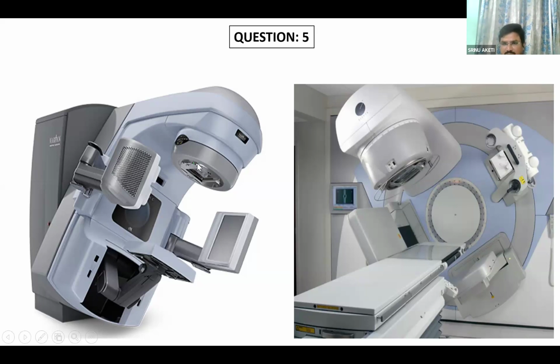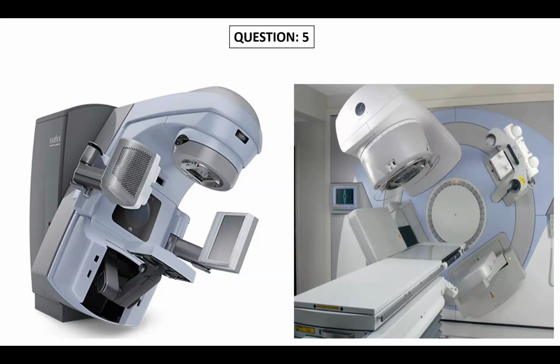So now, can you explain something about this? What is this? What is this? Yes, sir. This is a treatment gantry, sir. And the down one is like a beam stopper. Which one is the beam stopper? Down one, sir, opposite to the collimator. Okay, opposite to the collimator. That is not a beam stopper, madam. That is EPID, portal imaging, 2D verification. We will take MV imaging and we will match it. That is EPID. It is not a beam stopper. Sir, parallel to this, perpendicular to this, that image will be taken with that, right, sir?